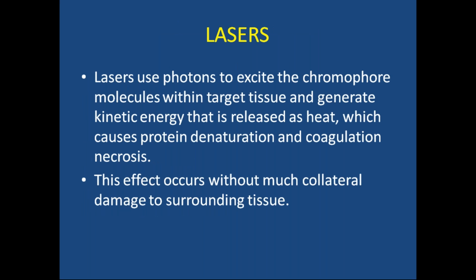Okay. So later, lasers are one of the advancements, which use photons to excite chromophore molecules within tissue and generate kinetic energy that is used as heat. This effect occurs without much collateral damage, whereas in the case of harmonic, monopolar and bipolar electrosurgical devices, collateral damage will be present. But in the case of laser, only the affected or pointed tissue that is required for resection is injured.